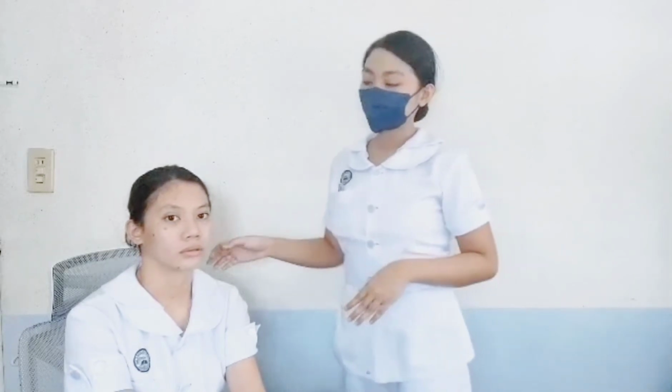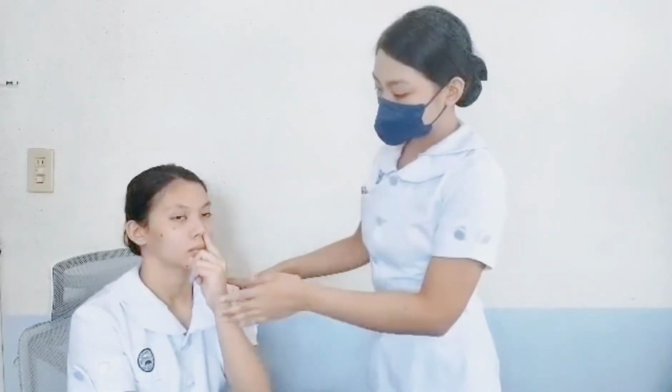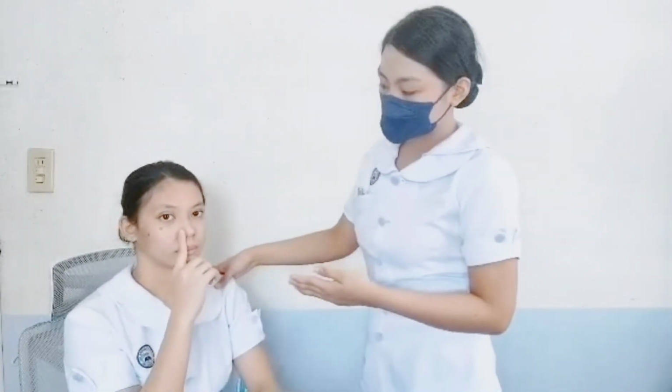Next is to determine the patency of both cavities. Ask the client to close the mouth, exert pressure on one naris, and breathe through the opposite naris. Repeat the procedure to assess the patency of the opposite naris. Inspect the nasal cavities using a flashlight or a nasal speculum.